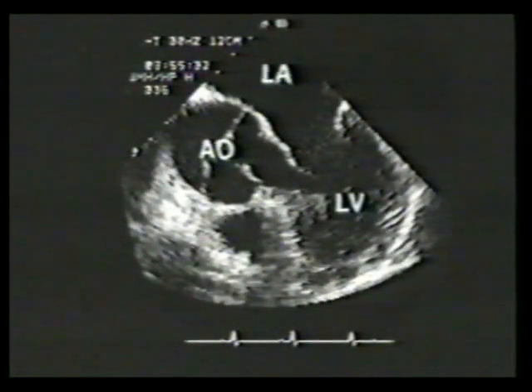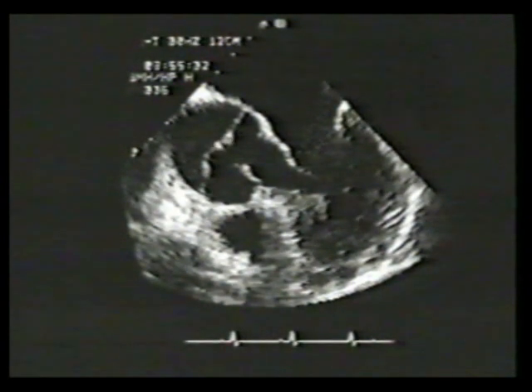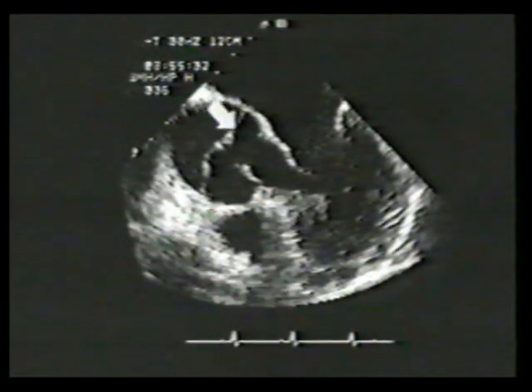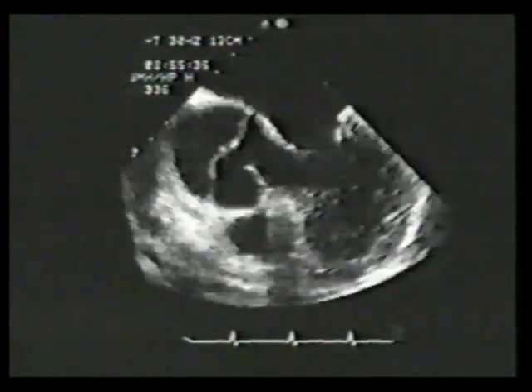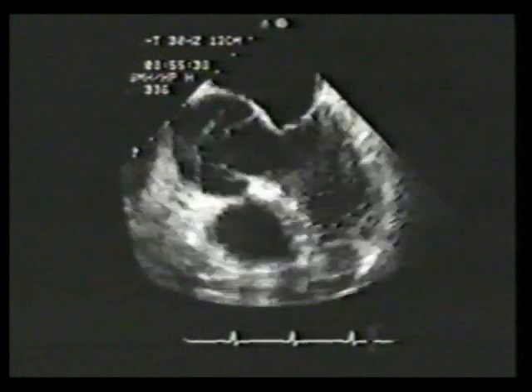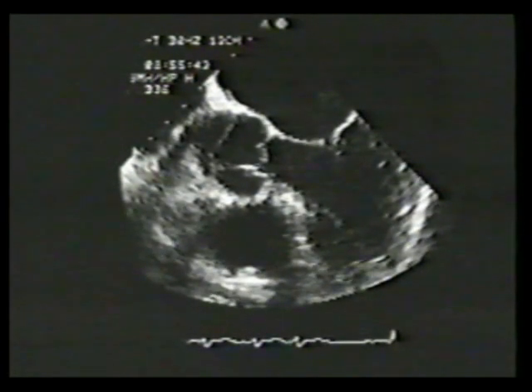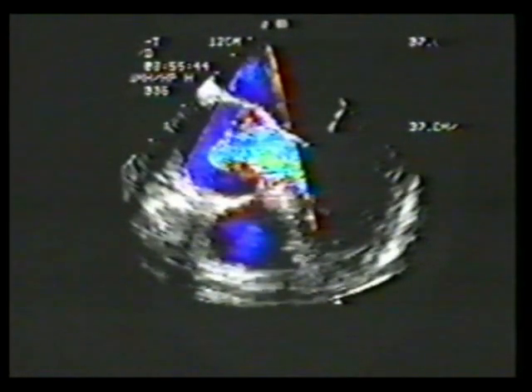Transesophageal echocardiography provides high-resolution images of the thoracic aorta. Since it can be performed rapidly at the bedside, it has become a mainstay for diagnosis of aortic dissection. This patient has a type 1 dissection, which was diagnosed via TEE. This is an intimal flap in the aortic root. In real time, you will see flail motion of the left coronary cusp. Flow imaging confirms severe aortic regurgitation.